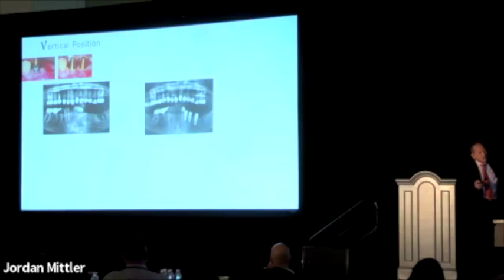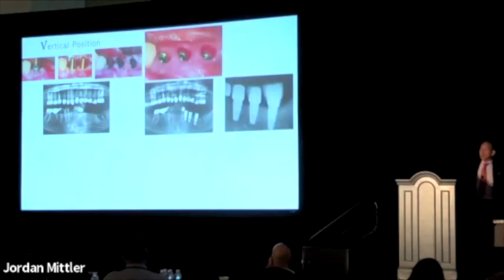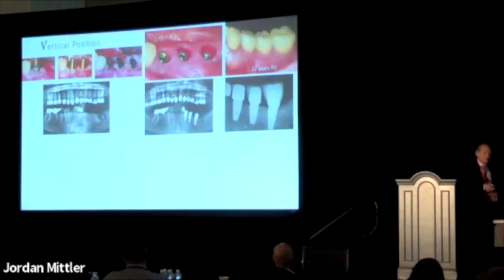So look, this is a case I did in 2006. I placed an implant supracrestal, crestal, and subcrestal. And you can see the soft tissue thickness. Soft tissue thickness should be at least 3 millimeters. Well, why is it there's different soft tissue thickness? It's dependent on implant position entirely, the vertical thickness.